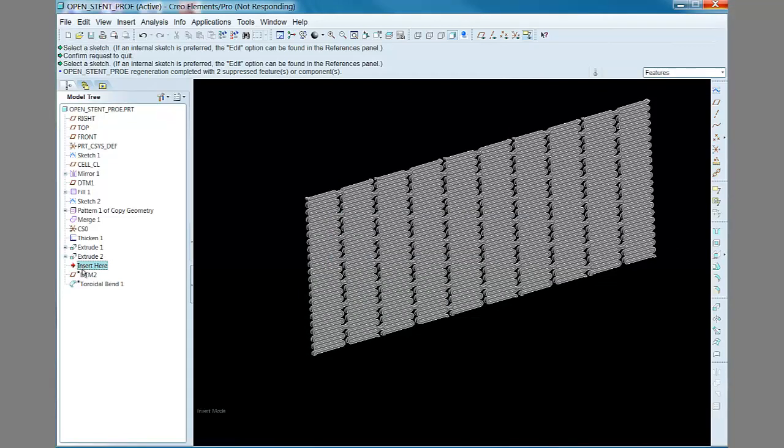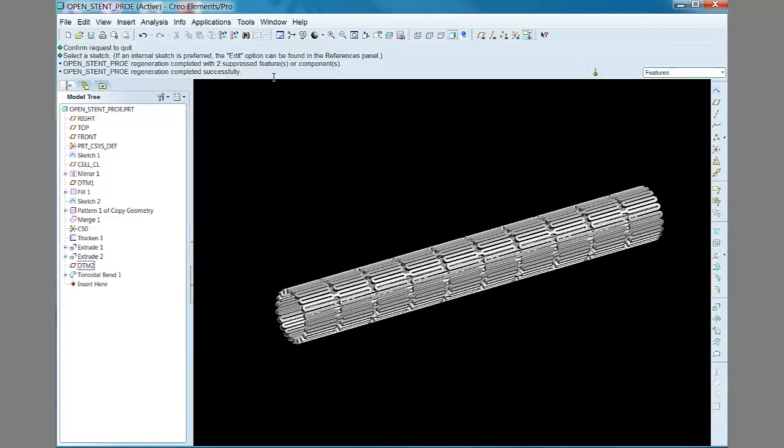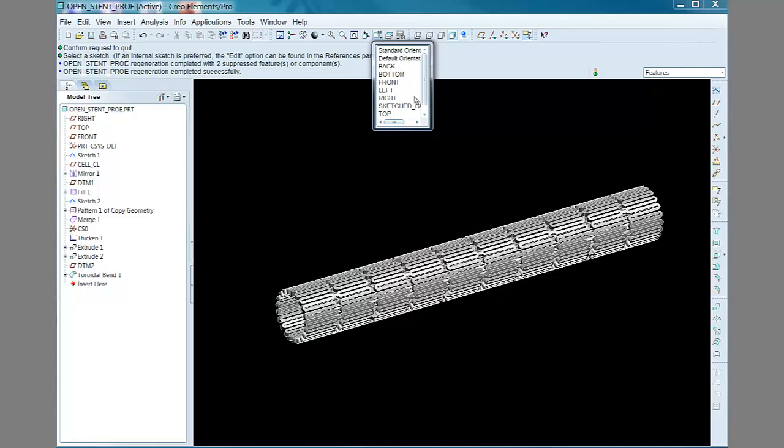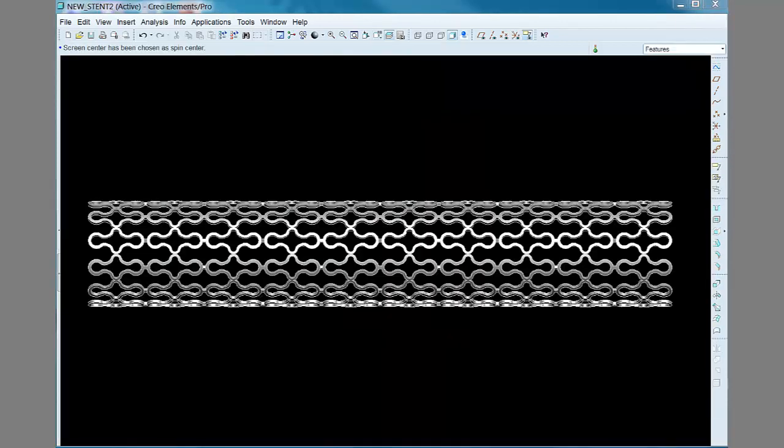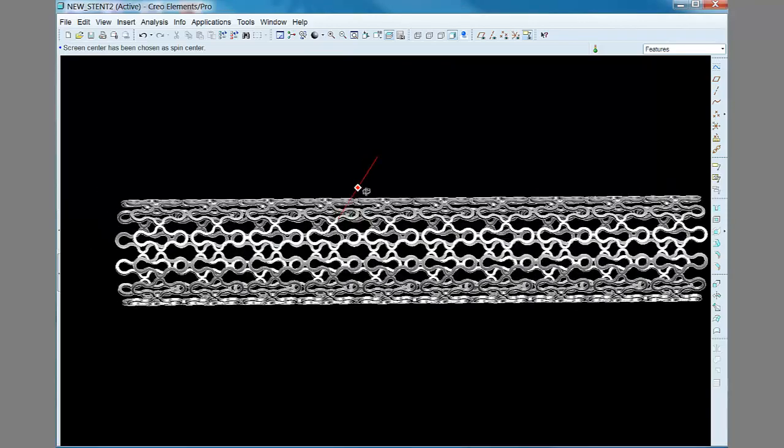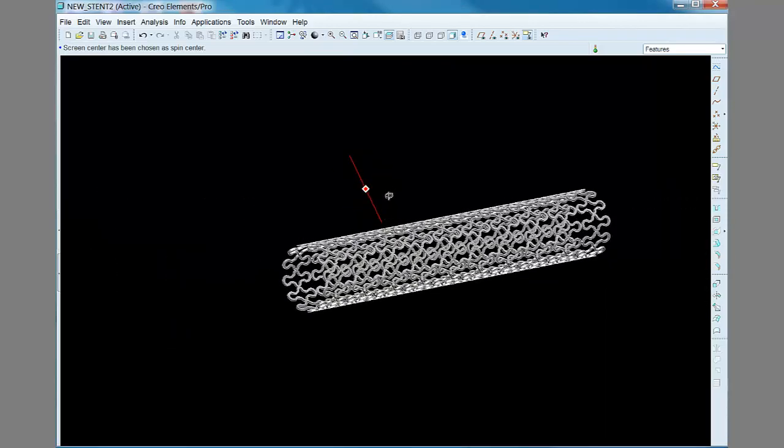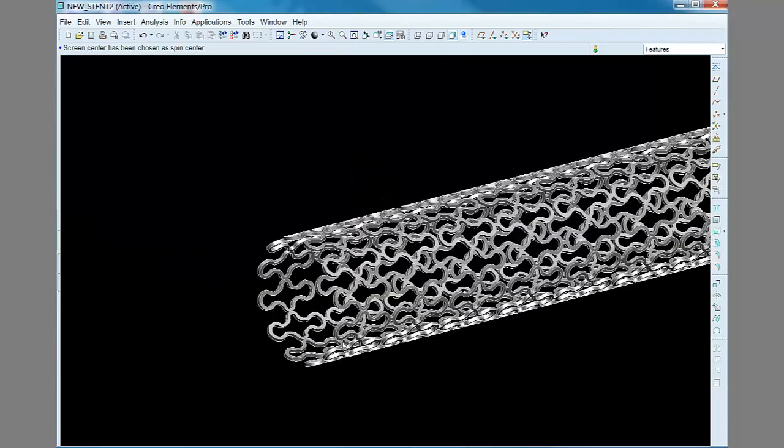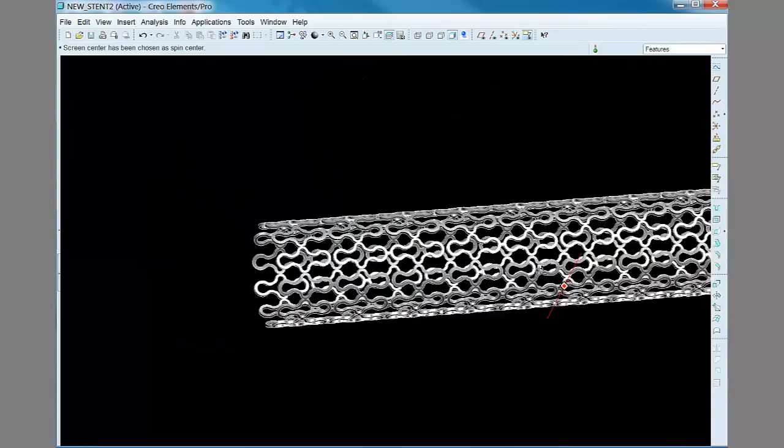Well, that's about all there is to it. You create your basic cell and you pattern it, then roll it up into a cylinder. Here you can see I was able to apply the same method to an entirely different unit cell geometry with similar results.